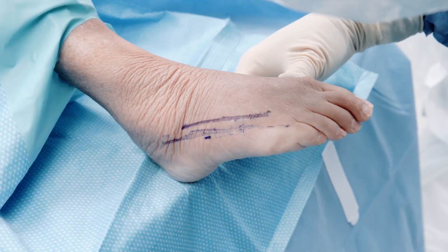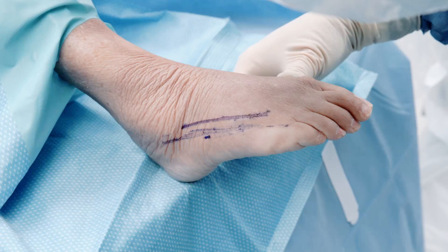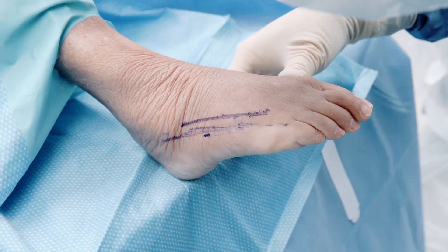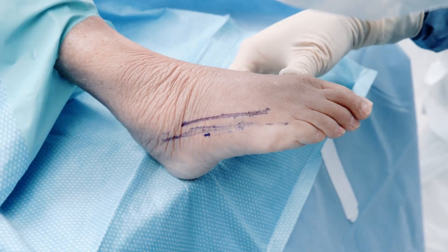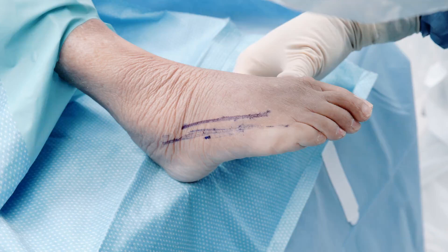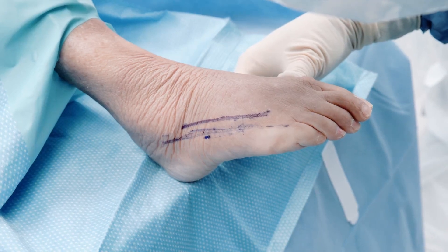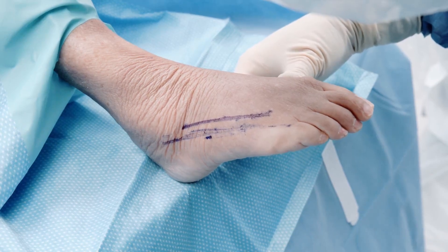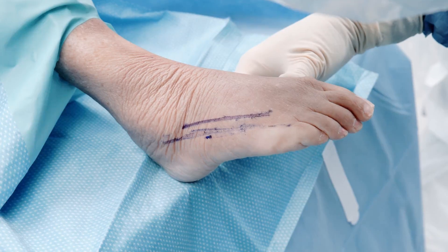Hello, I'm Jim McWilliam from White Plains, New York, and I'm going to talk about minimally invasive surgery on the foot with regards to bunionette deformity. So if there's a large intermetatarsal 4-5 angle or if there's significant lateral bowing of the 5th metatarsal, you might want to perform your correction via a more proximal osteotomy.